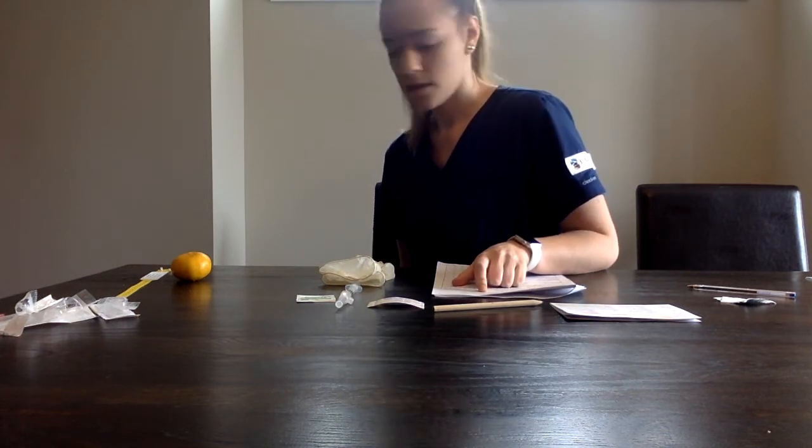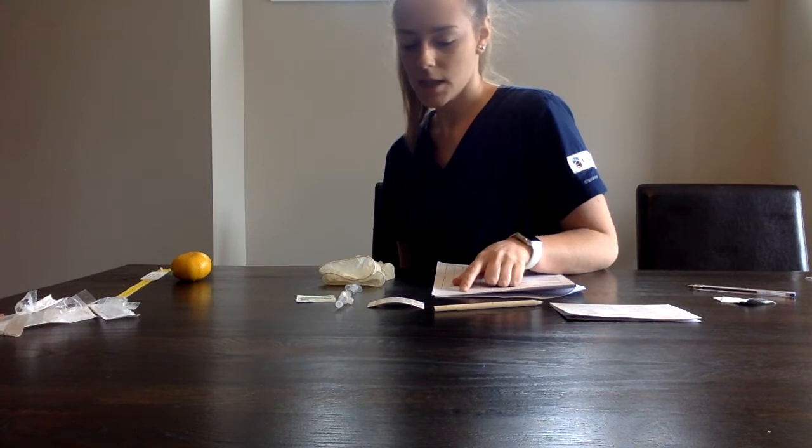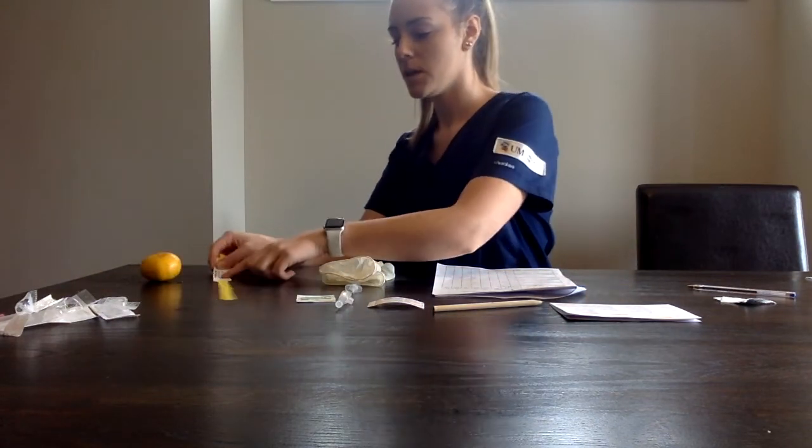Can you tell me your first name and your last name? Nursing Jake, and your date of birth? January 1st, 1960. And Jake, do you have any allergies? No allergies? Okay, I'm going to double check with your armband here. So we have nursing Jake.